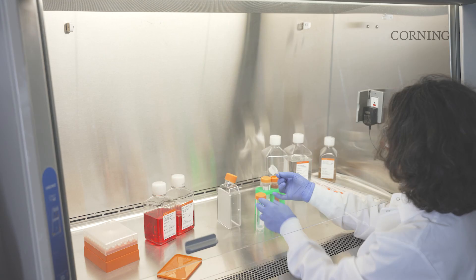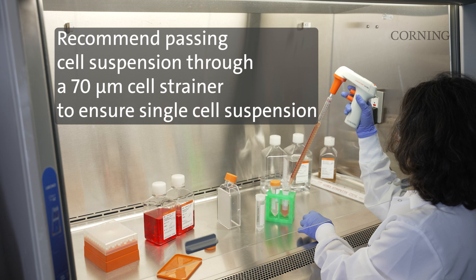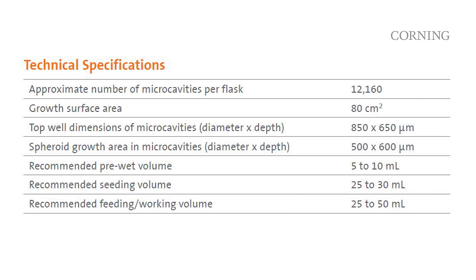Some optimizations of cell culture conditions and handling will be required depending on cell type, seeding density, and desired culture time. To seed the cells, prepare a cell suspension at the desired seeding density in 25 to 30 milliliters of complete cell culture medium. Place the flask in the upright position and dispense the cell suspension to the bottom of the flask.